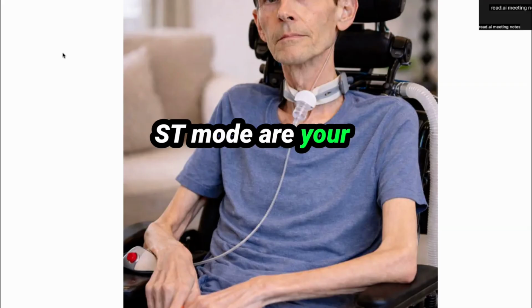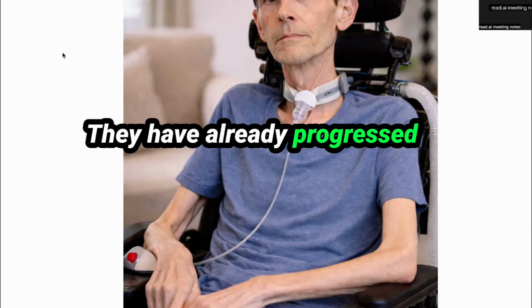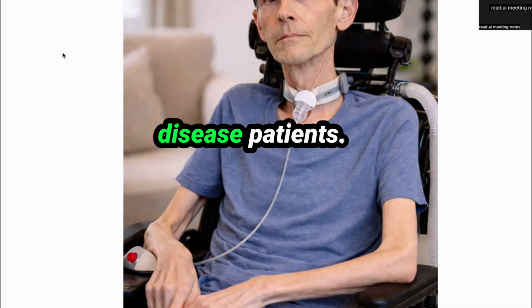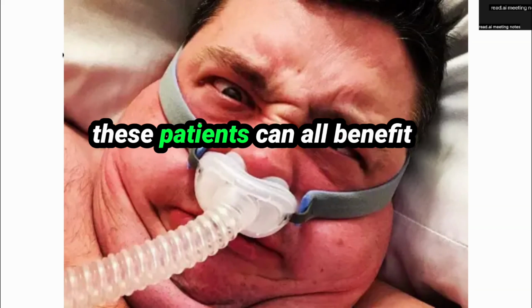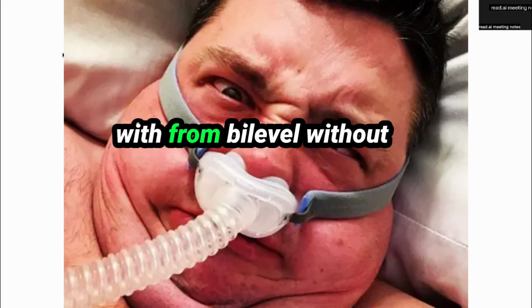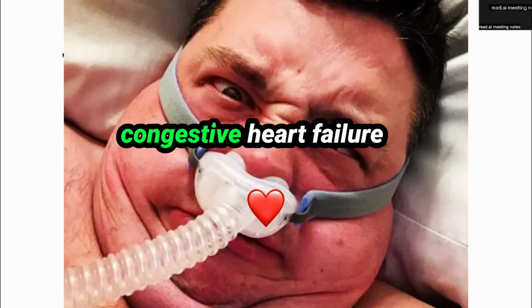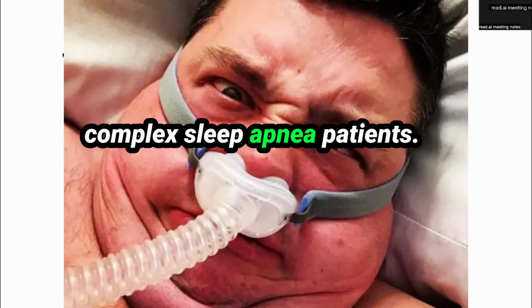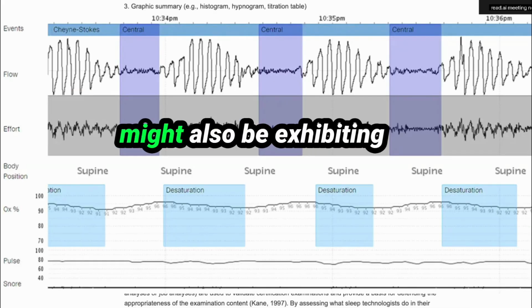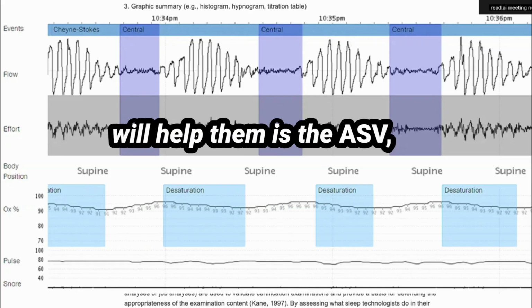ST mode are your COPD patients that are a little bit worse. They have already progressed with the disease state, and your neuromuscular disease patients, also your obesity hypoventilation patients. These patients can all benefit from bilevel without or with a backup rate. Then you have your congestive heart failure patients and your complex sleep apnea patients. Now, these patients might also be exhibiting Cheyne-Stokes respiration. So the only mode that will help them is the ASV.